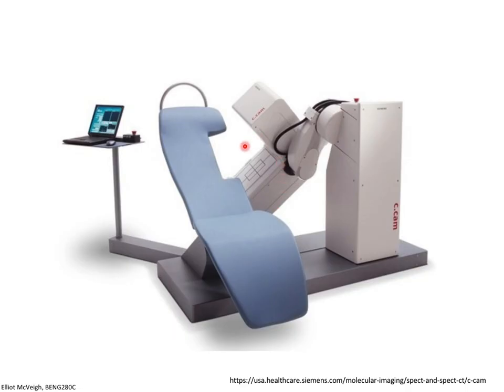So here is from the Siemens website a system that can be just plugged into the wall, basically, in a doctor's office. And so cardiologists in private practice can just have a room in their office suite that has one of these, and they can just do it to everybody, right? So it's widely available, right?